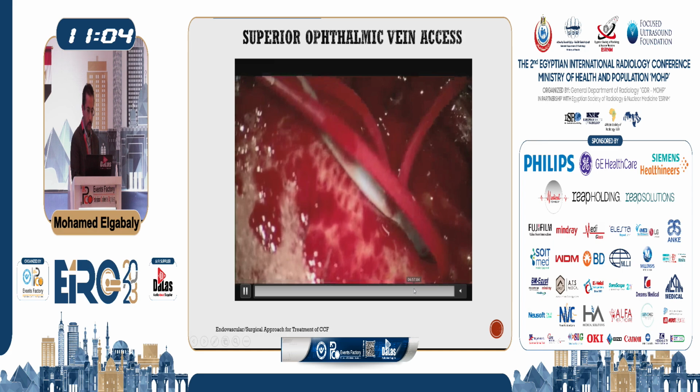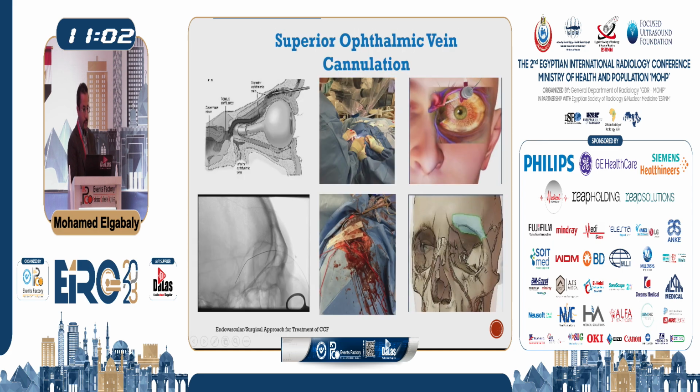All right. So in terms of access, again, this is what we did. Basically access to the superior ophthalmic vein. The advantage of the superior ophthalmic vein is that it's straight, it's valveless. When it arterializes, it's fairly robust in terms of exposure to injury, and it provides a good route to the cavernous sinus. So this is again what we did here. You can see here the sheath going in. There's the ophthalmic vein. Here's our wire, ophthalmic vein up to the cavernous sinus, followed by our 4 French sheath.